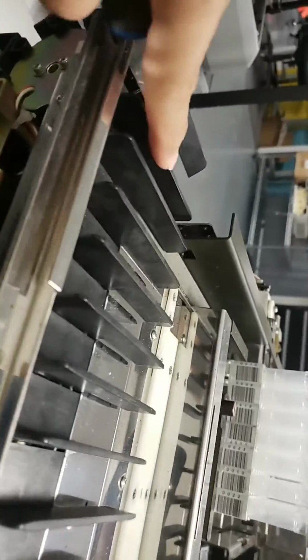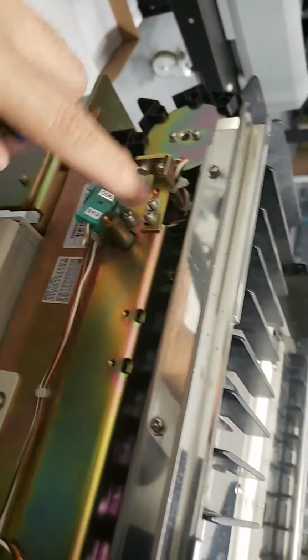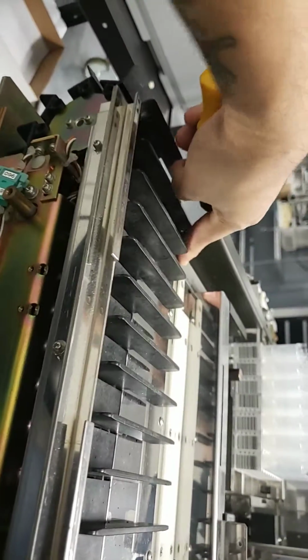Same thing with this corner. If it's coming off of this belt here and transitioning to this belt, and it's too high on this end, then this will have to be lowered so the belt is higher up, so it climbs up and this belt grips it as it takes it up. So hopefully that helps out.